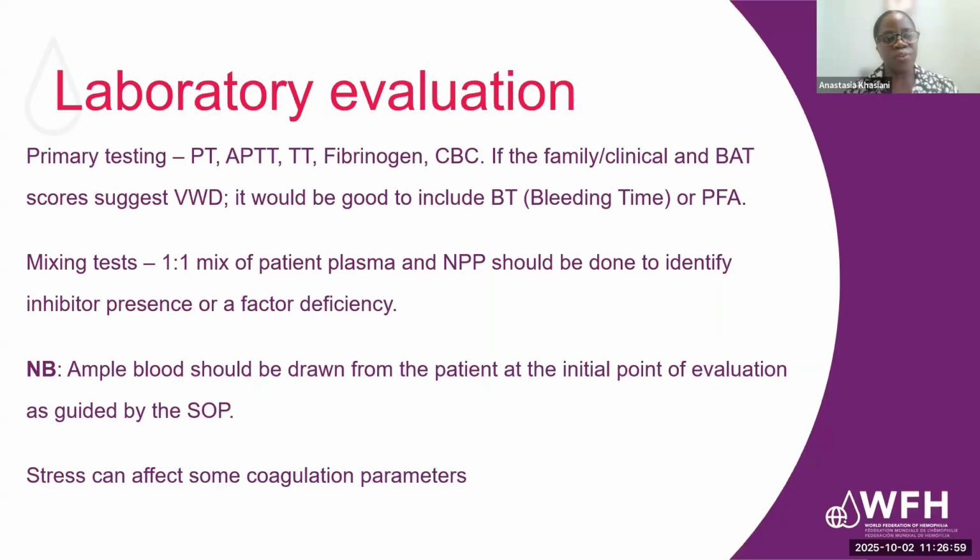So in your laboratory evaluation, you begin with the screening tests. This will help you to find out where the abnormality is. Just to give some context, all the tests that I've included in my outline are mainly in regards to if you are presented with a patient who may have a bleeding disorder. There are other times when the patient may have other forms of coagulation disorders.